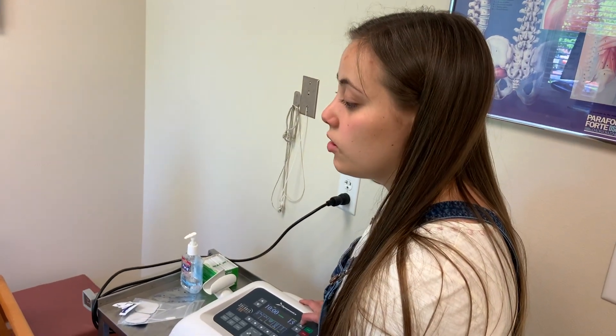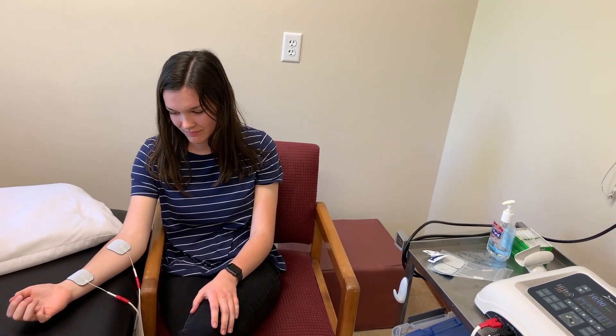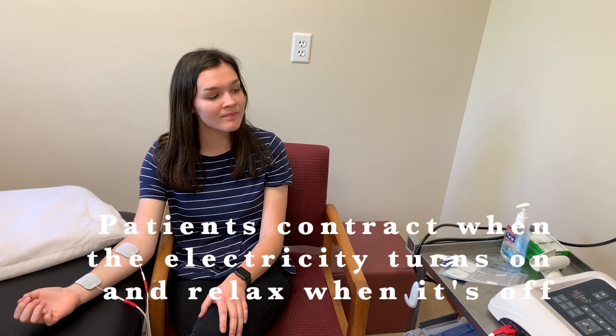We want there to be a strong contraction, but no pain. And while you do feel the contraction from the stimulation, I want you to also contract your muscles at the same time.